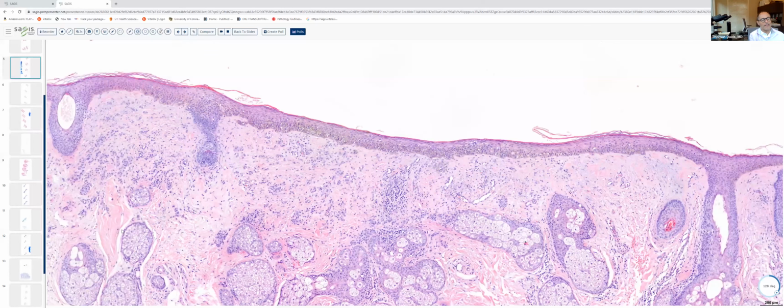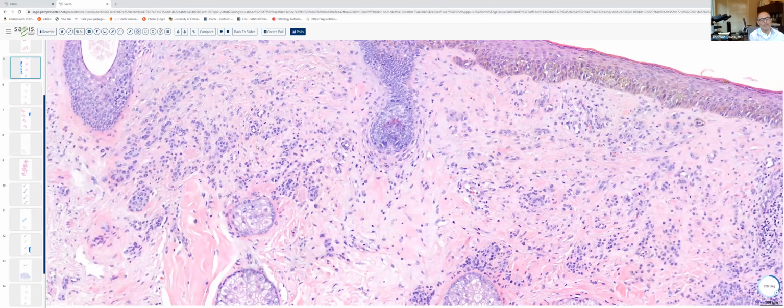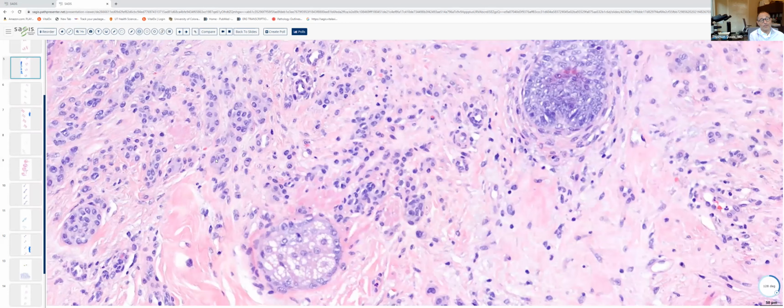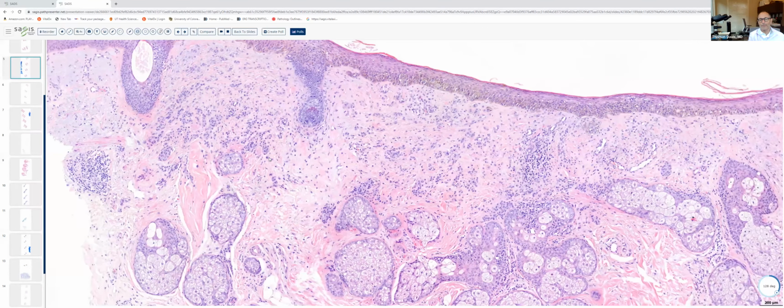Furthermore, if we look in the dermis beneath the zones of fibrosis, we've got orderly nests, cords, and strands of uniform melanocytes here within the dermis. There's no nuclear hyperchromatism. There's evidence of maturation, no mitotic figures. So we can breathe a little sigh of relief, because this constellation of findings with normal appearing melanocytes beneath the zone of fibrosis and an unusual melanocytic proliferation in the epidermis only above the zone of fibrosis is highly suggestive, if not diagnostic, of a persistent melanocytic nevus.